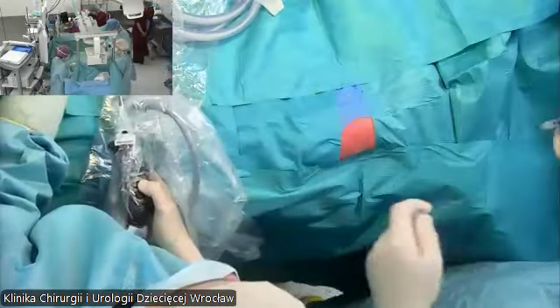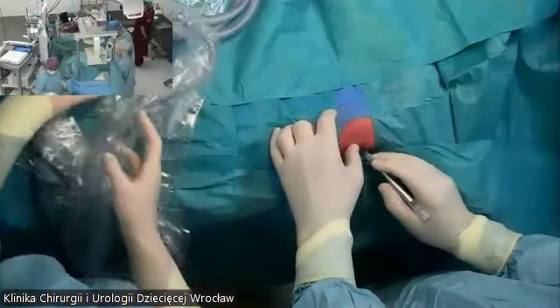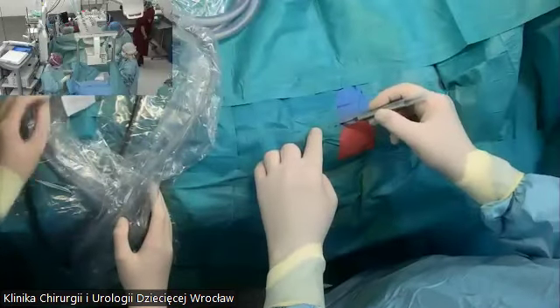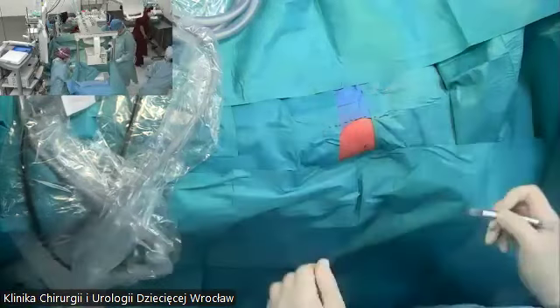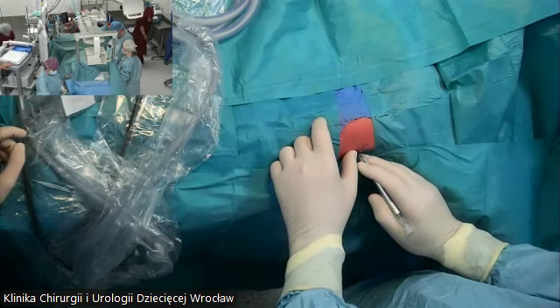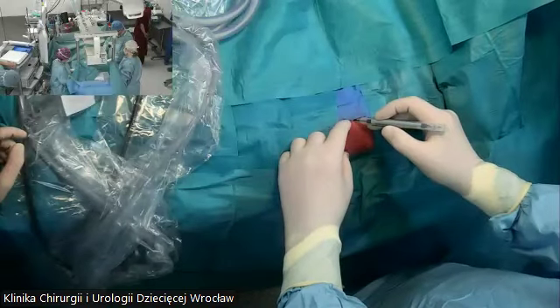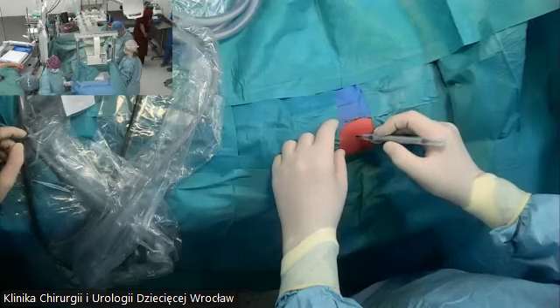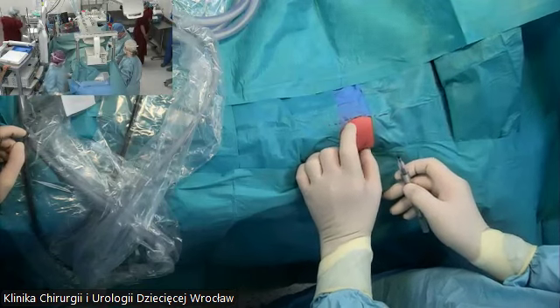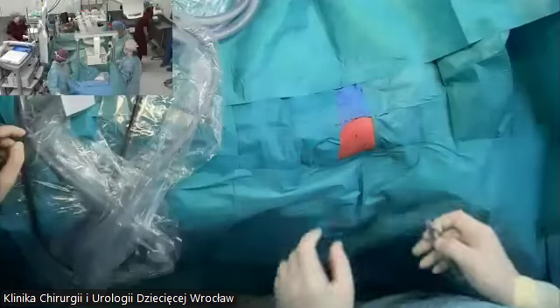So just to show everyone how we place the trocars. This is the scapula. The baby is completely in a prone position. This is the vertebra. The first trocar is just below the tip of the scapula, about 1 centimeter below. Another one we will put halfway between the vertebra and the first one, somewhere here. And the third one we'll put at the posterior axillary line, high into the axillary fossa. So it looks like this.